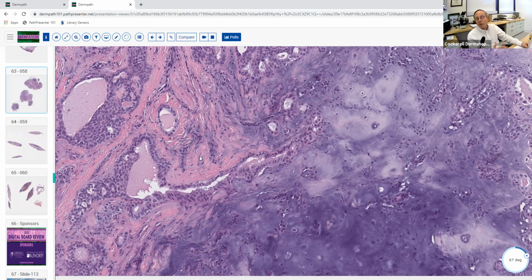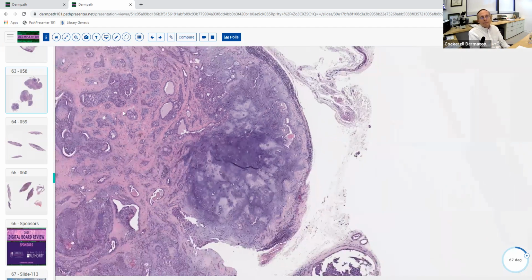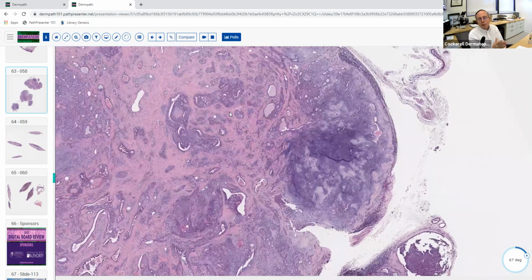And it's not a cellular neurothekeoma, which gives you epithelioid cells and doesn't give you any of these. The cellular neurothekeoma doesn't really give you much mucin. The nerve sheath myxoma variant of neurothekeoma gives you mucin, but that gives you little whorled areas of spindle-shaped cells demonstrating neural differentiation. So this is really the only one of those choices that would make any sense to you if you know anything about dermatopathology. Hopefully you'll figure this one out pretty quickly.